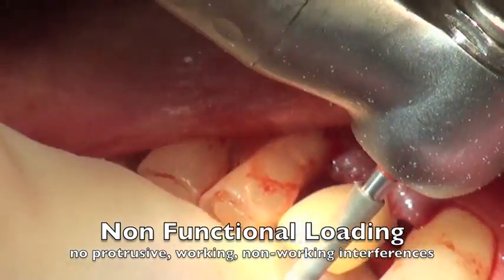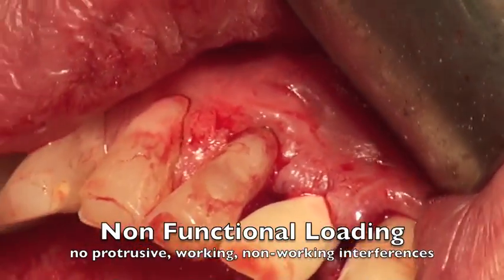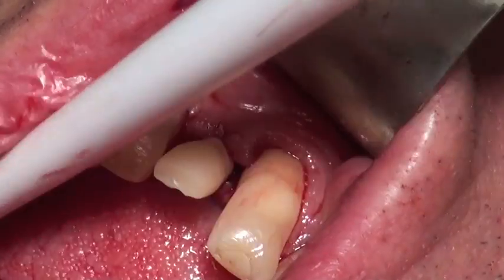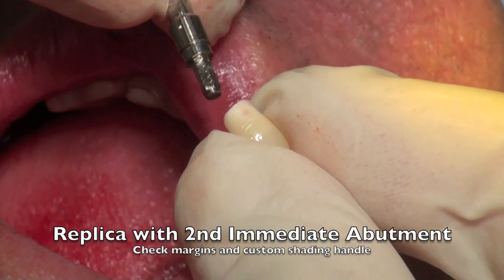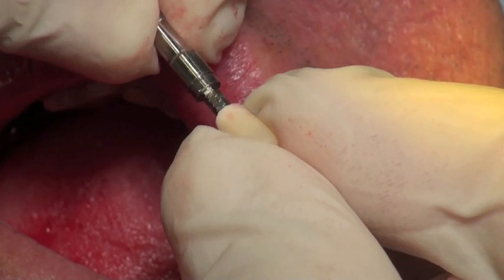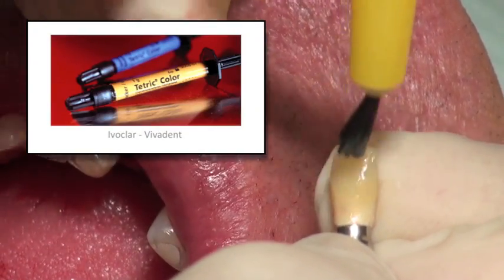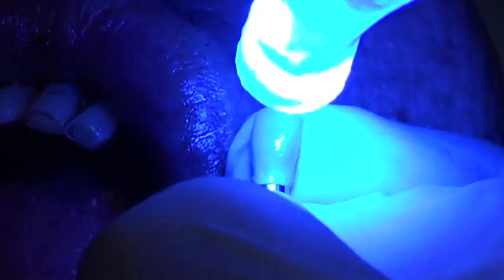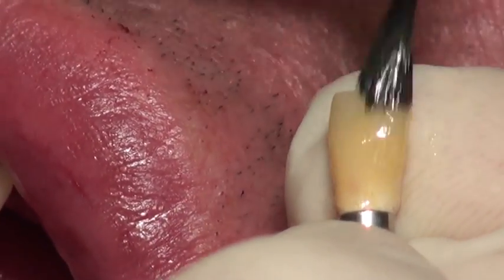Then I adjust the occlusion. We want this in a non-functional loading situation — no protrusive, no lateral working, no non-working interferences at all. It's basically just to look good and help shape the gingiva. I like to use a replica and attach a second temporary abutment as a handle for shaping the resin and doing custom shading. I apply some stain — here we're using Tetric Color from Ivoclar Vivadent — painting it on and light-curing it so the tooth looks really nice for the healing process. I'll also apply some clear bond on top just to make it look a little shiny.